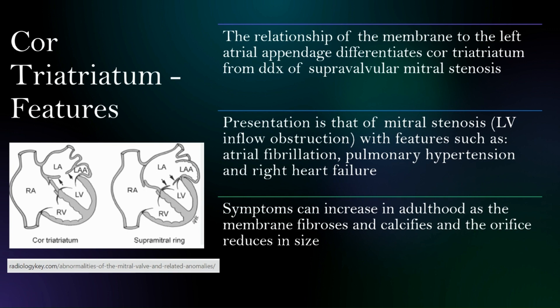When we look at them, the relationship of the membrane to the left atrial appendage does differentiate cor triatriatum from the differential diagnosis of supravalvular mitral stenosis. In the image here, we can see the membrane arising below the level of the left atrial appendage, whereas here it's actually above, proximal to the origin of the valves, because both may have a similar membrane-type appearance.